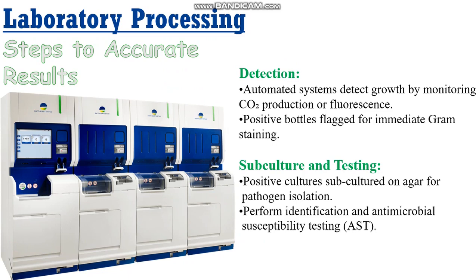Once a bottle is flagged positive, the lab performs a gram stain to quickly identify the organism morphology. Positive cultures are then subcultured onto agar plates to isolate the pathogen. From here, identification tests and antimicrobial susceptibility testing are conducted to guide treatment decisions. This structured approach ensures reliable diagnosis and facilitates the delivery of appropriate and timely patient care.